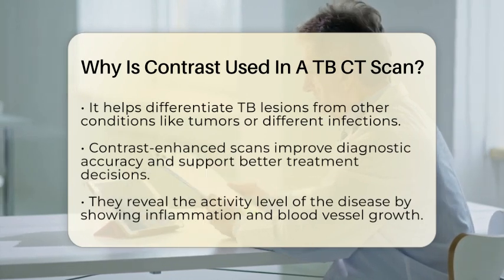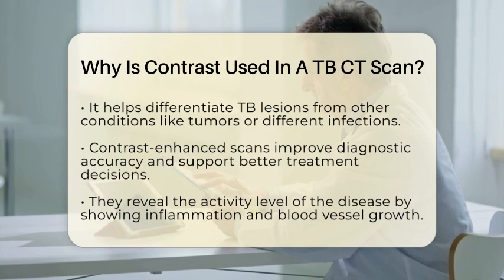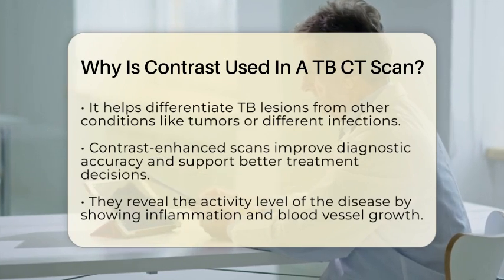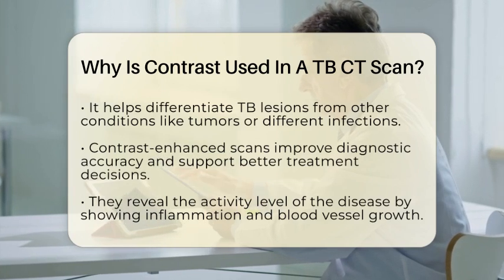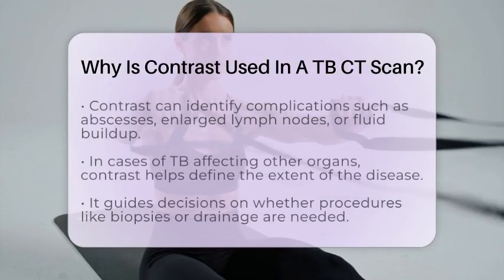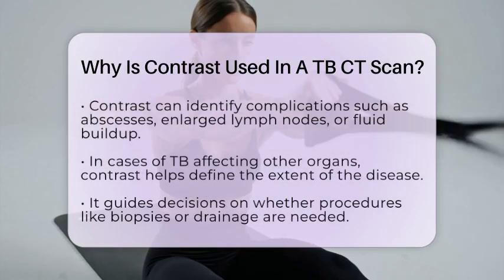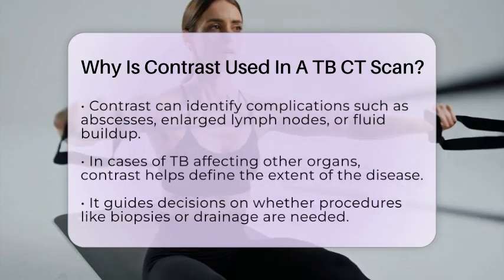Studies have shown that scans with contrast provide more accurate and confident diagnoses, leading to better treatment decisions. Contrast also helps reveal how active the disease is by showing which areas are inflamed or highly vascularized. This can help doctors see how severe the infection is, monitor how well treatment is working, or spot complications like abscesses or enlarged lymph nodes.